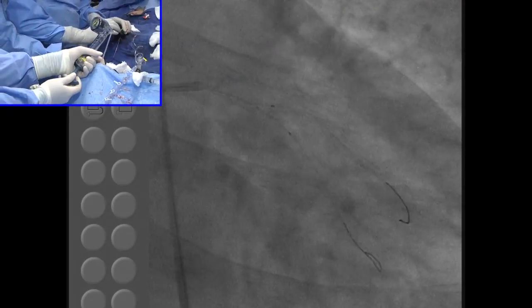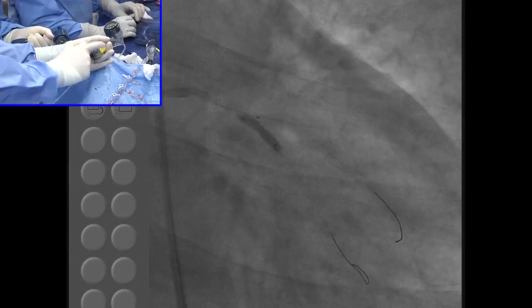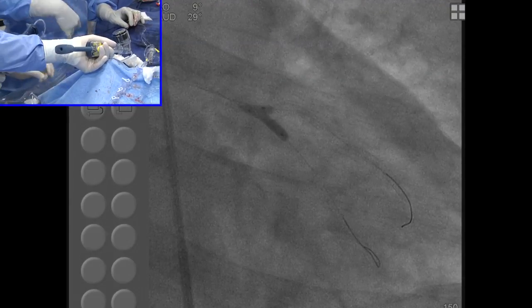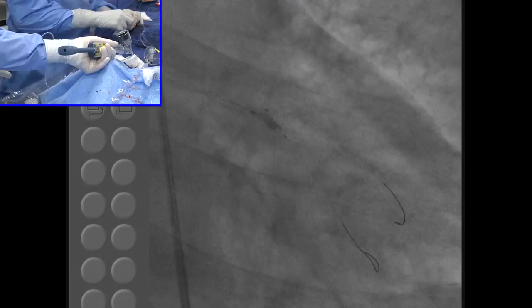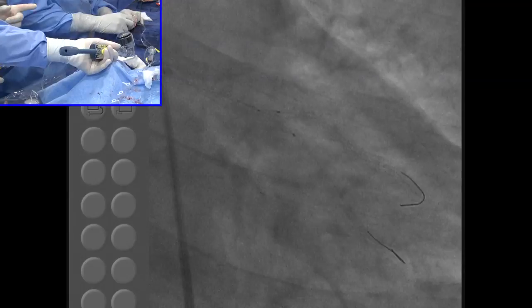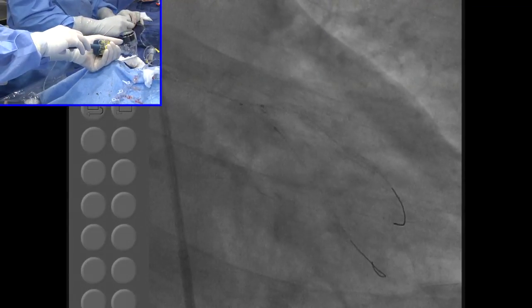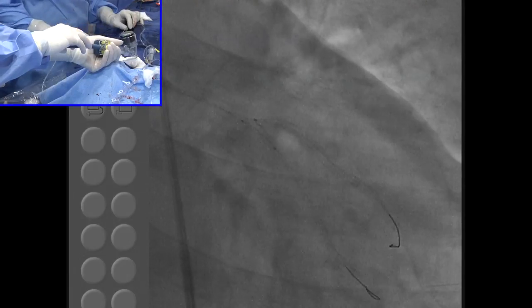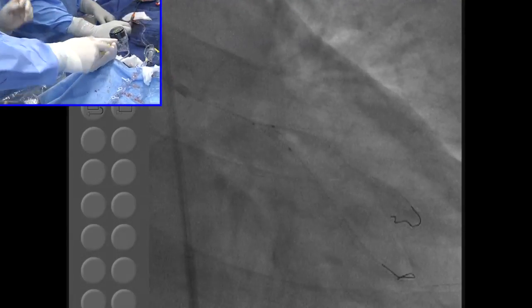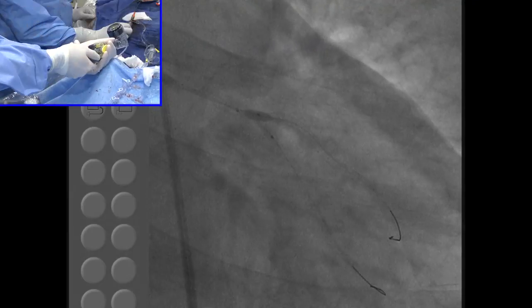Okay, now you go. Although these will slip. It went out. I think it didn't go. It slipped one-to-one. You can go your regular 20 atmospheres. Okay, go. You want to pull back the Glider first? Let's open the ostium nicely. Pull back more. Good. Pull back the main vessel balloon. Good. Go with the Glider. Go. I want to open the ostium nicely. That's 16, 18. 18. Good.